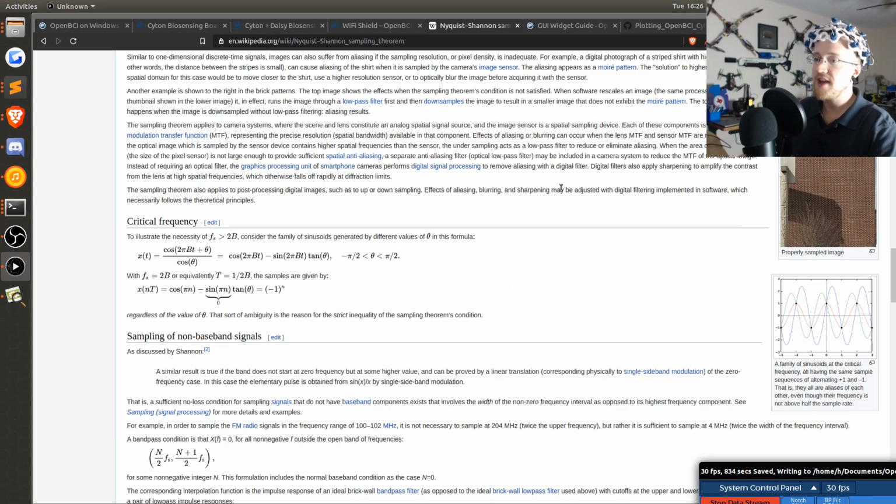So moving on, now that we know those things, what is our objective, right? Our objective is, at least to start, I want to move something on the screen. And as you've already seen, I'm starting to get there, but how do we do it? I want to use deep learning, so we need something useful to pass through this neural network model. I did start with OpenBCI, doing my own signal processing with SciPy. This is fairly complex. It's not that hard, but you need to account for any fluctuations in the actual sampling rate. Ideally it's 125, but sometimes that's coming faster or slower. So it's hard to account for that, and I just don't know, do I need to account for that?